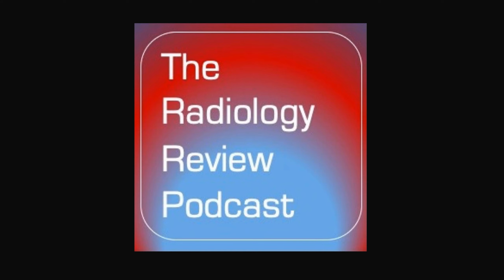On board exams, twinkle artifact would be most classic for something like renal stones. And you can use twinkle artifact to your advantage when you see a highly echogenic structure that you think might represent a stone or calculus. You turn on the color Doppler imaging, you see it twinkle, and this adds support that it is in fact something like a renal stone and not an echogenic mass.